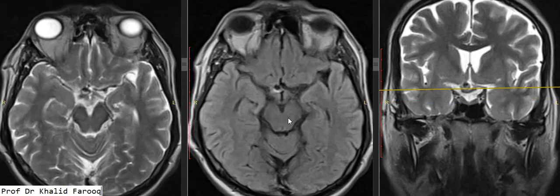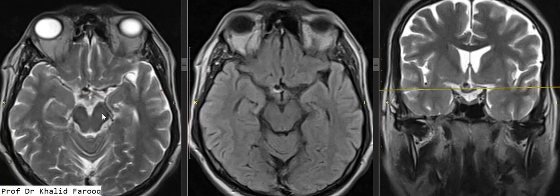Here we can see there is a tiny aneurysm which is just inferior and superior to the right side of the optic chiasm. Here we can see the optic chiasm is minimally compressed and displaced downward and posteriorly as well.